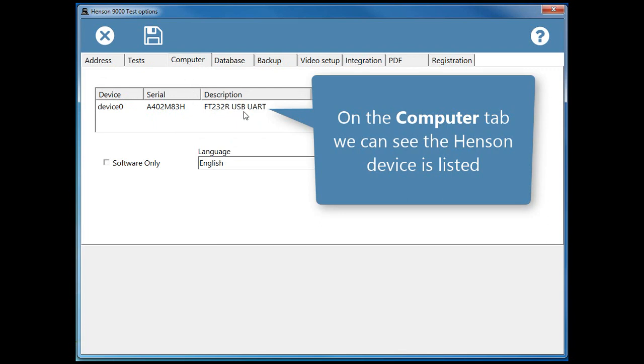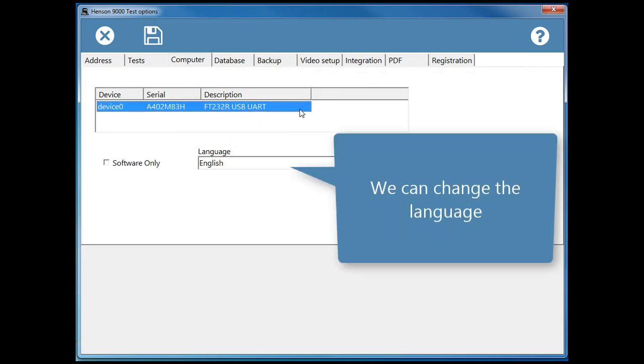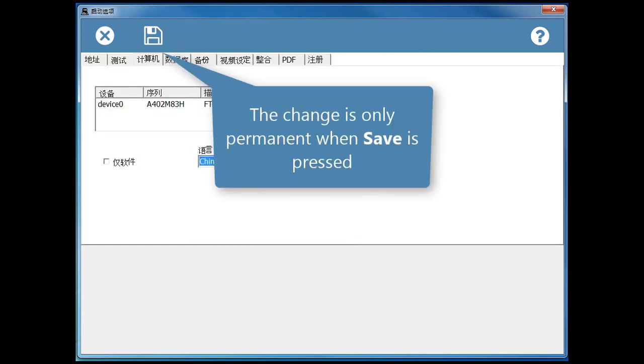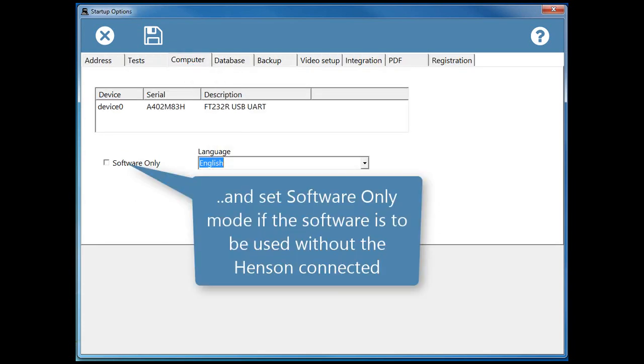On the Computer tab we can see the Henson device is listed. We can change the language. The change is only permanent when save is pressed. And set Software Only mode if the software is to be used without the Henson connected.